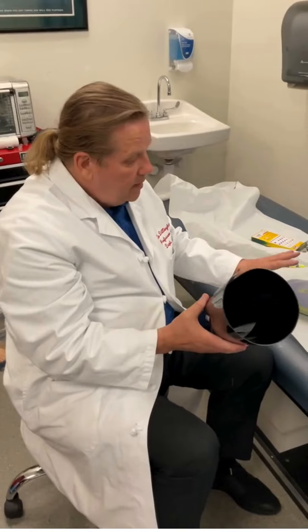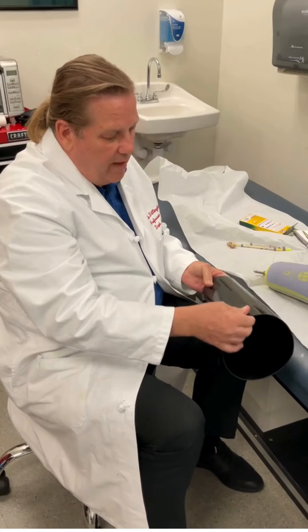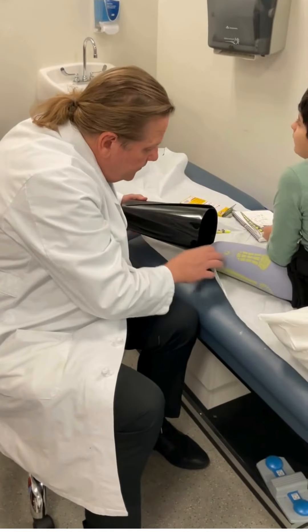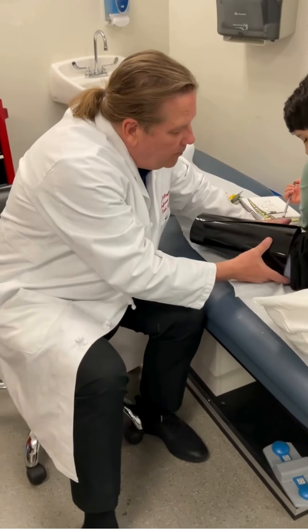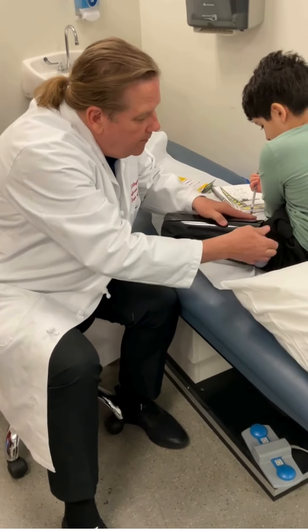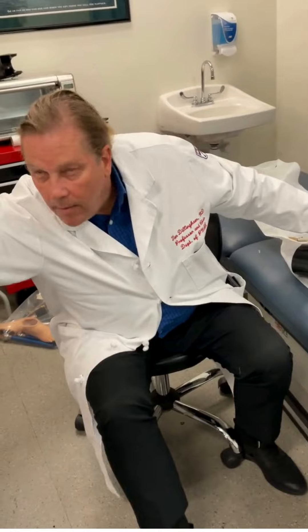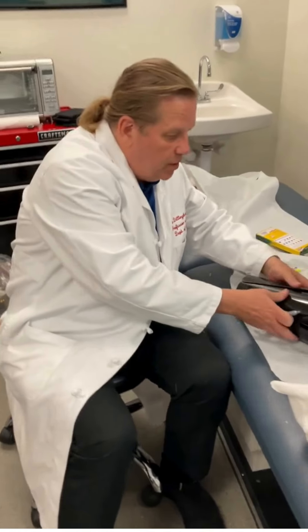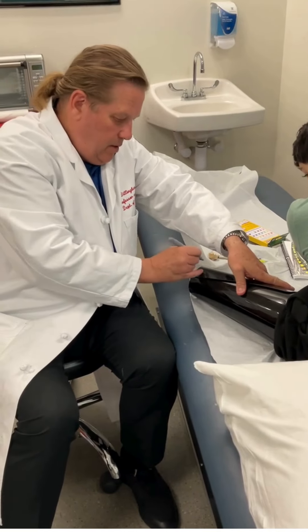So for this, this is going to be his left side, so the outside of the flap needs to be like this. I'm going to put it on, just slip it on, and I'll see, I'll measure, I'll put it where it's going to be in the amount of overlap and see how much I need to cut. And you want to overlap about that much, so I'm going to end up cutting here.